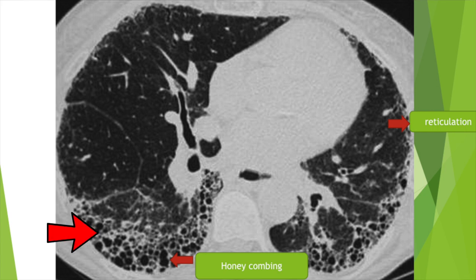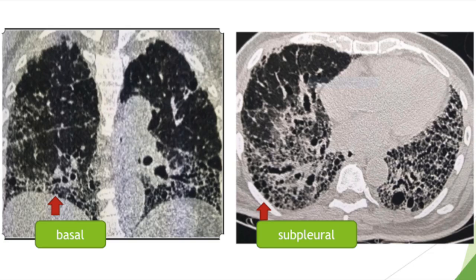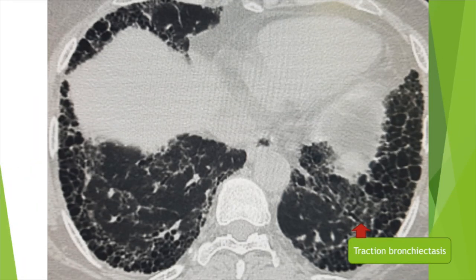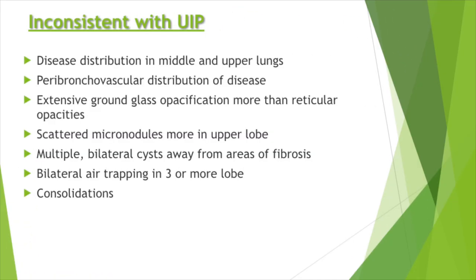Looking at the radiological features of typical UIP: there is honeycombing, which are layers of cysts stacked over one another, and linear opacities called reticulations. These are in subpleural location with basal predominance. We can also see some dilatation of bronchioles due to the pull of adjacent fibrosis.